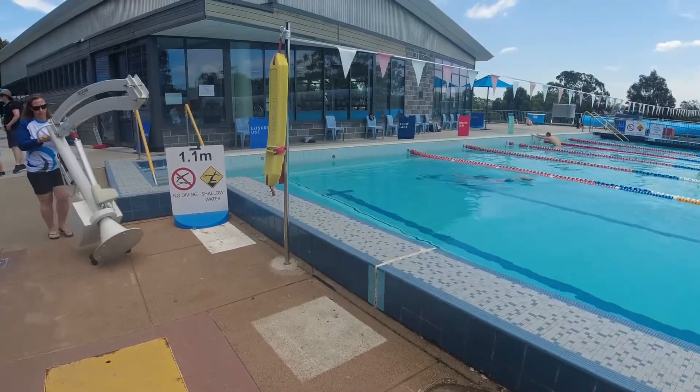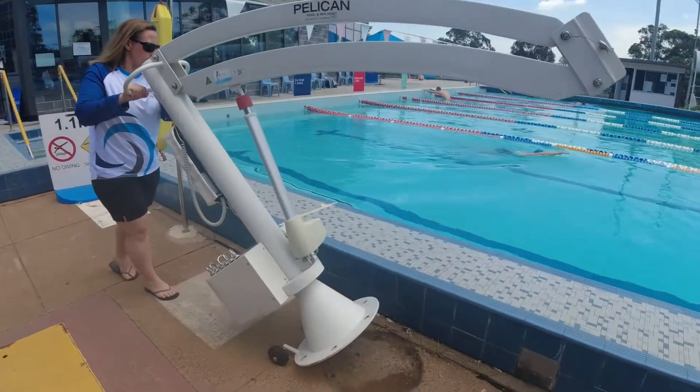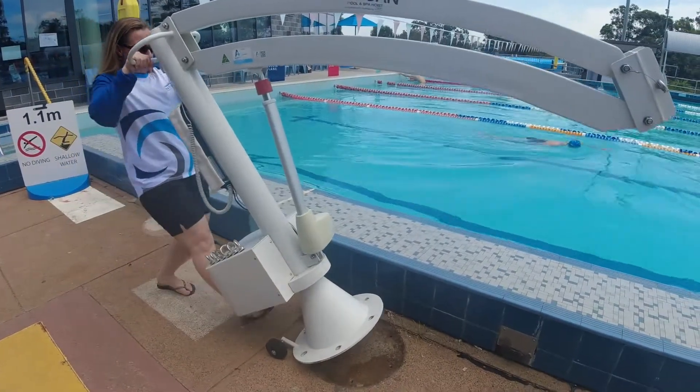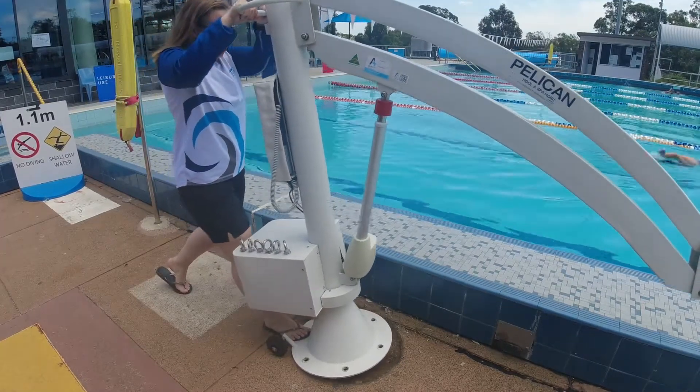Ensure the Pelican arm is pointed in the forward position of the transport wheels. Then tip backwards like a hand trolley and wheel the hoist to the pool deck and place the base plate over the anchor points.